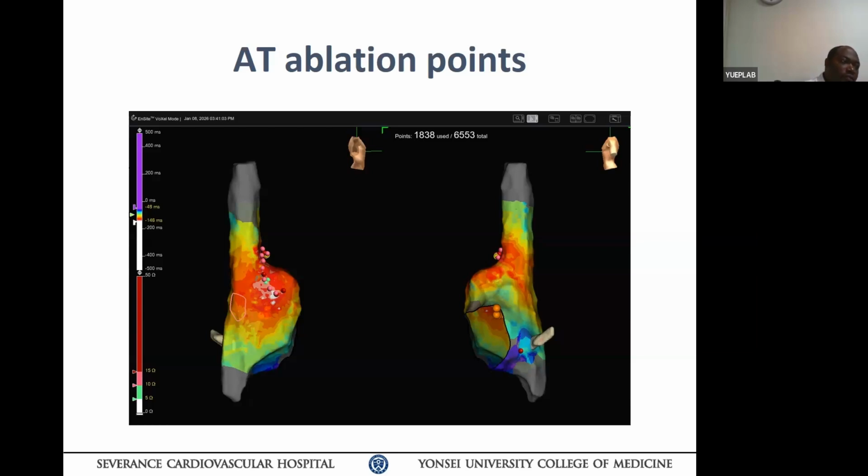Another thing I would do one more time: in this map, on the right side, you see the bundle tagging they did, the golden tag? You want to make it as wide as you can. There's a slow pathway ablation point, the red spot. Yes, but then you have to ablate twice. But the first one, I didn't use a 3D map at that time. That's no excuse, okay? Come on. That's why there's one point. Nobody uses it. Come on. But if you become a US doctor, everybody uses 3D to ablate SVT.